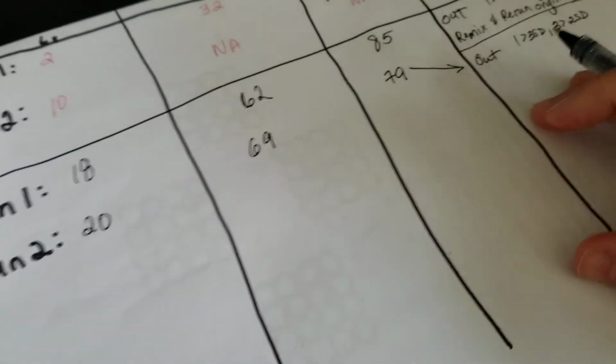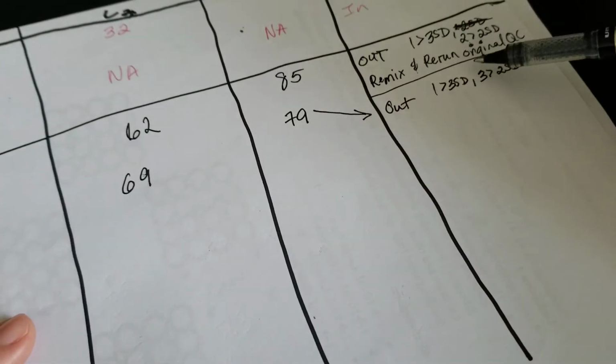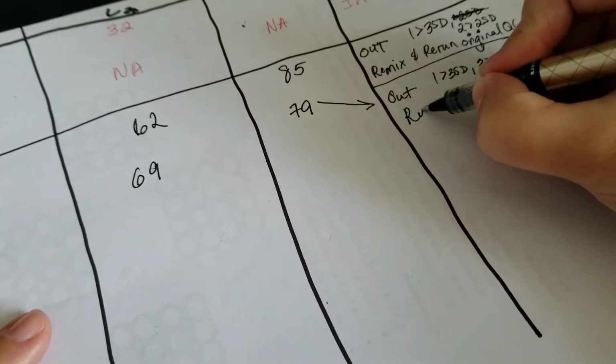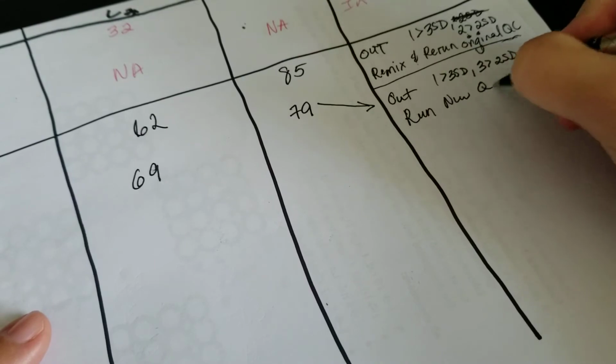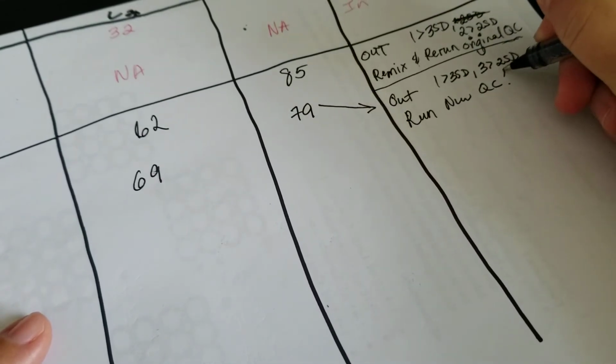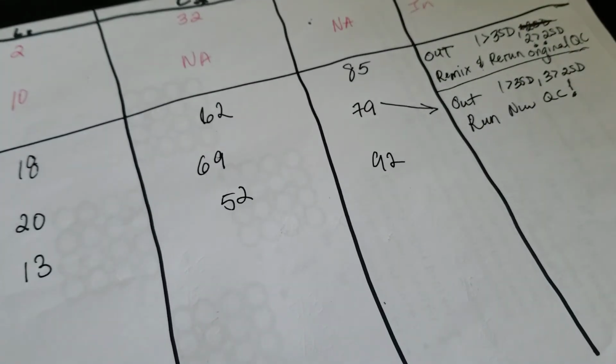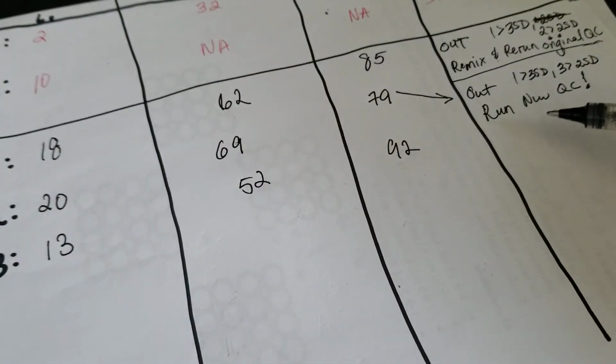Okay, so what do we do now? Oh my gosh. So we remixed and reran the original QC. So the next thing that we do is run new QC. Run new QC. All right, so let's see what happened then. All right, so the third run of QC is with all three levels of new QC. Okay, so we ran new QC for levels 1, 2, and 3.